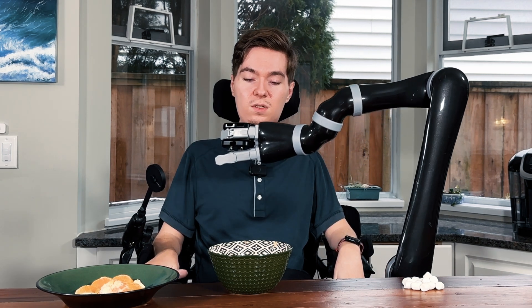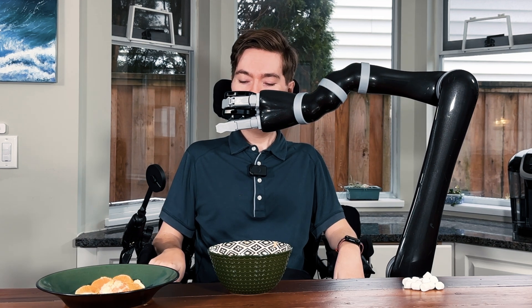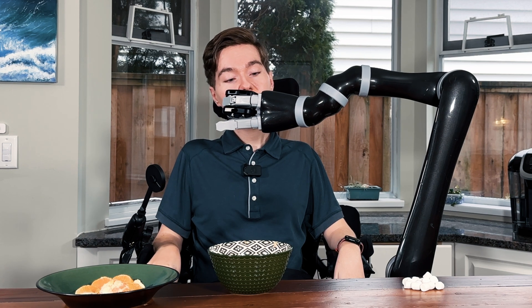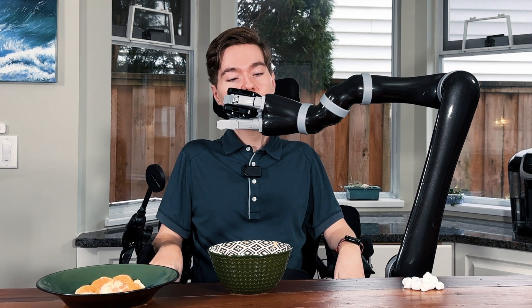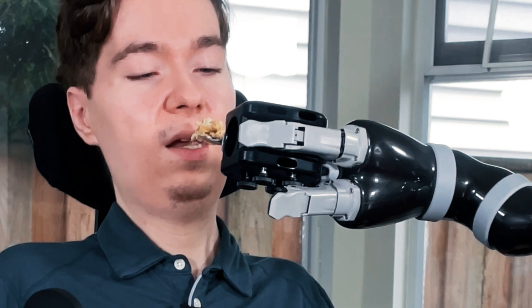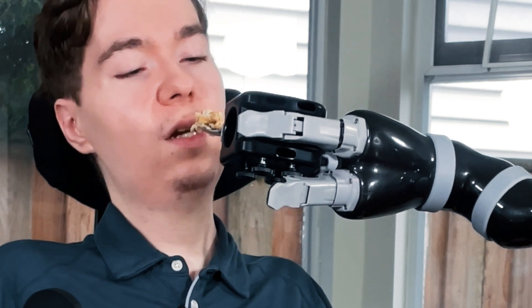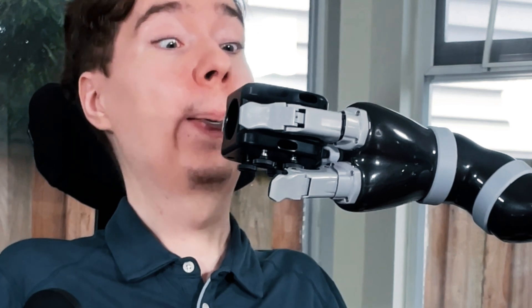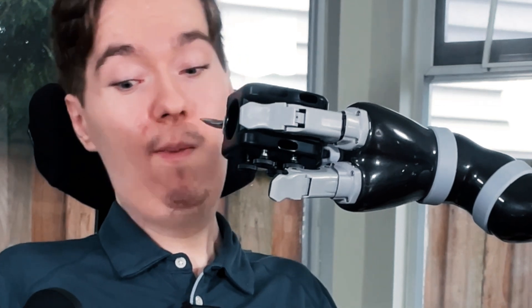I'm going to lift, and I'm now going to point the spoon so that it is going straight into my mouth. I am lined up on my mouth, I'm just going to raise it up a little bit more. There we go. With our oatmeal out of the way, that went very well.